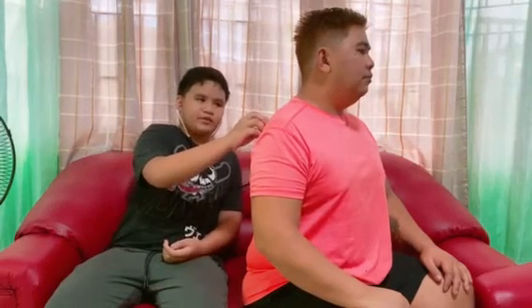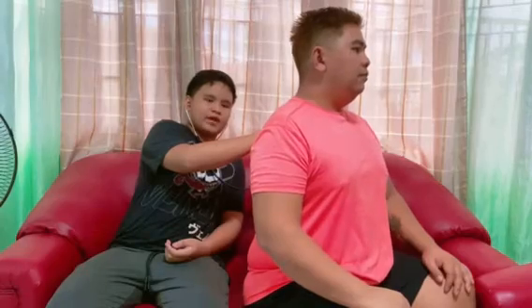With listening to the lungs, the patient must sit upright. Breathe in, breathe out. Breathe in, breathe out.